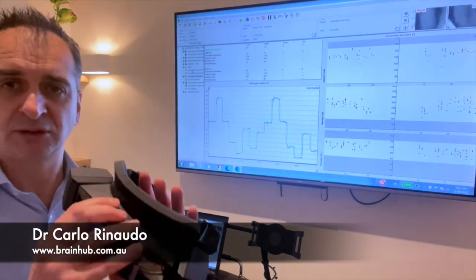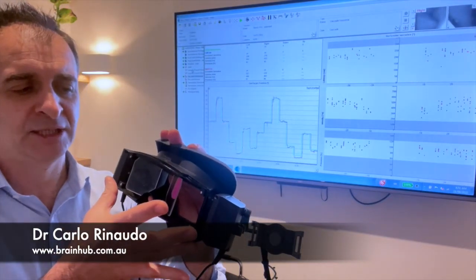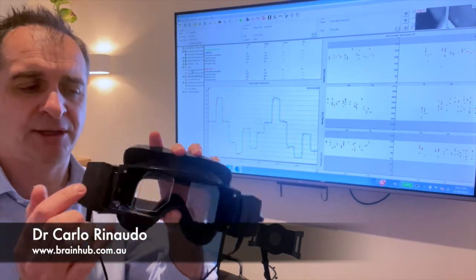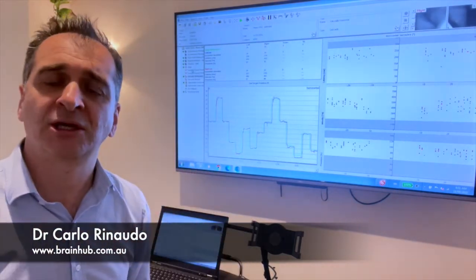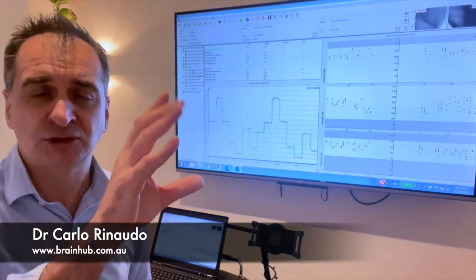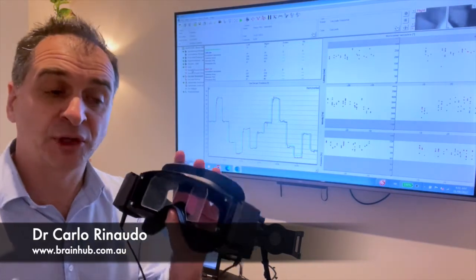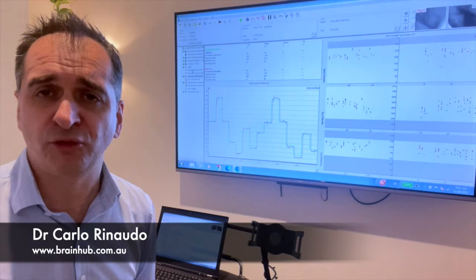So the goggles themselves, this is what they look like. There are a set of goggles that have infrared cameras embedded inside with these reflective lenses. The patient looks at the screen and the screen might have a dot or stripes or whatever it is that we're assessing at the time. And we're able to record very accurately the quality of those eye movements.